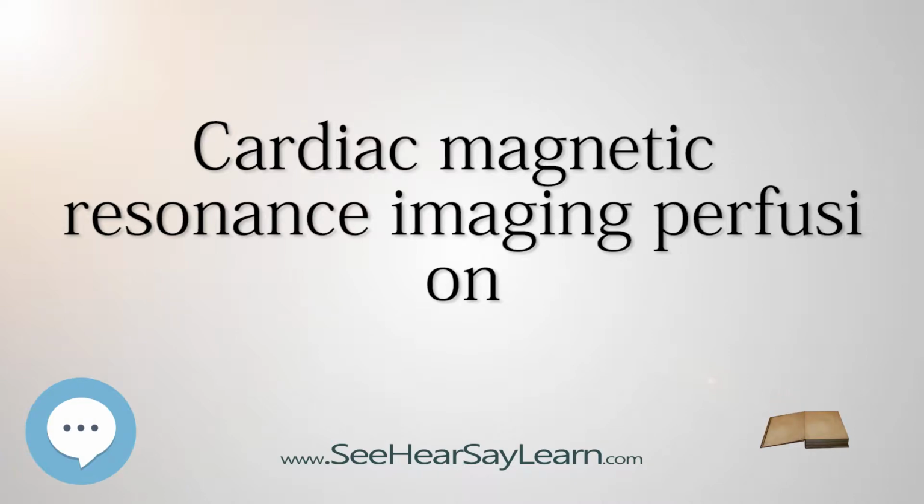Introduction. CMR perfusion is increasingly used in cardiac imaging to test for inducible myocardial ischemia and has been well validated against other imaging modalities such as invasive angiography or FFR. Several recent large-scale studies have shown non-inferiority or superiority to SPECT imaging. It is becoming increasingly established as a marker of prognosis in patients with coronary artery disease.